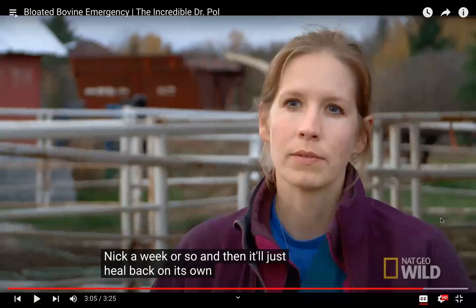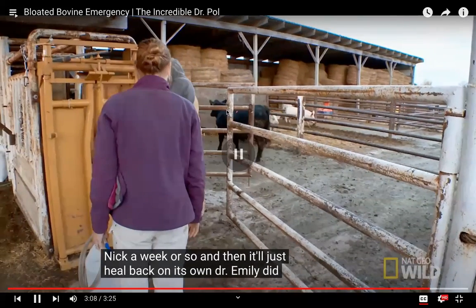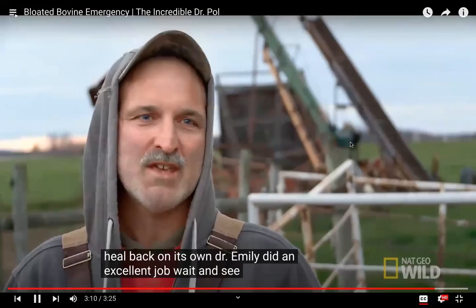So that trocar can stay in that patient for, like she was saying, up to a week to help with that gas release. If that patient continues to have problems, they might have to do further diagnostics and procedures, but usually that's enough to resolve it. So he'll have that right just on the side of his abdomen. Did an excellent job. Wait and see.